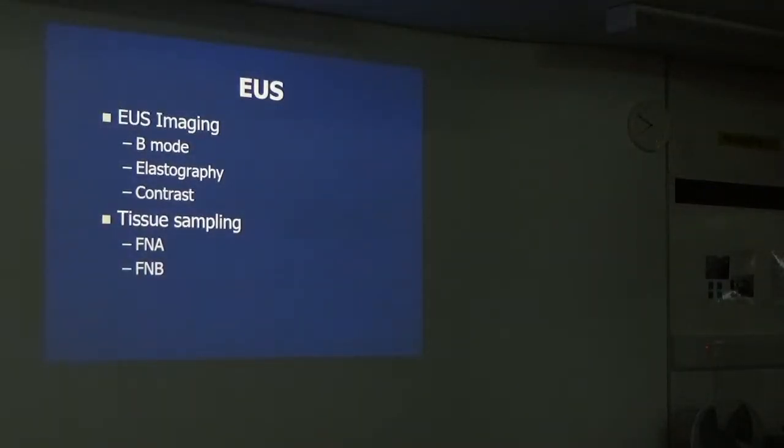And with the endoscopic ultrasound, there are various techniques. We can inject contrast, which is not the same as the contrast you get with an X-ray, but one that picks out fine flow in blood vessels, and as I said, you can take samples of tissue.